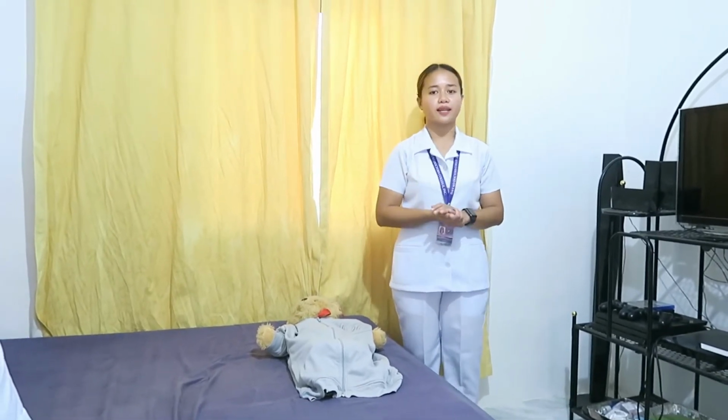Each breath should be given over 1 second. Then ensure the visible chest rise with each breath. This will allow lung expansion. And lastly, resume the compressions in less than 10 seconds. So, give the rescue breath. Note the visible chest rise while giving each breath. Perform 2 breaths. The last part of this procedure is the AED, or the automated external defibrillator.